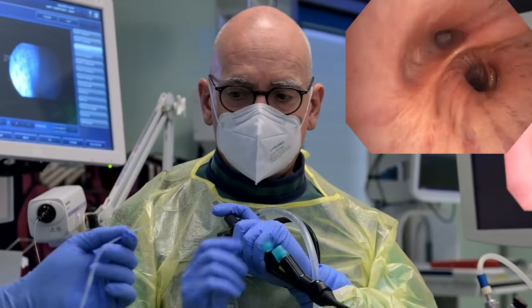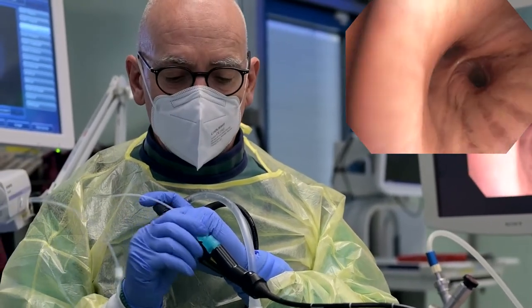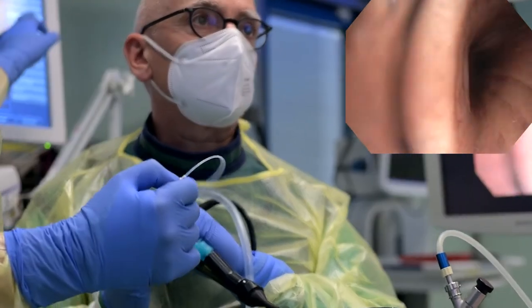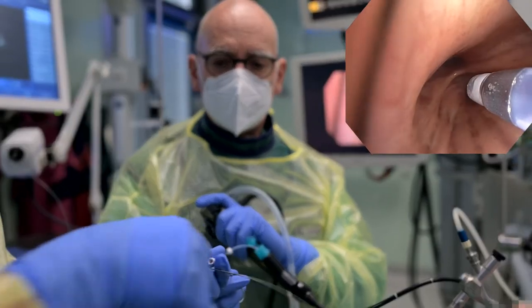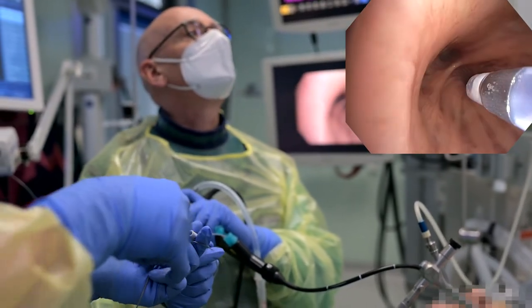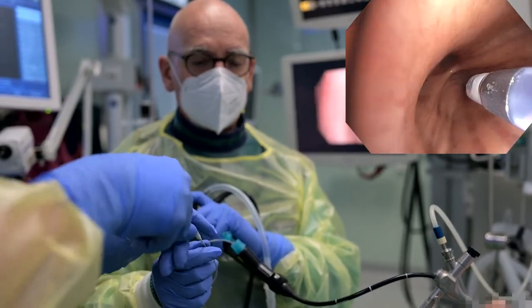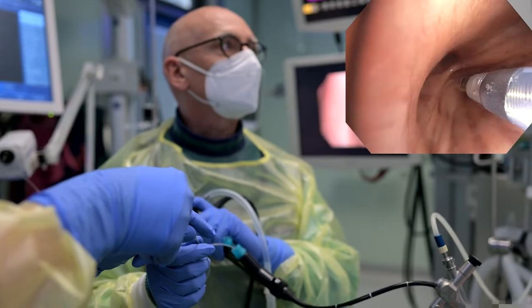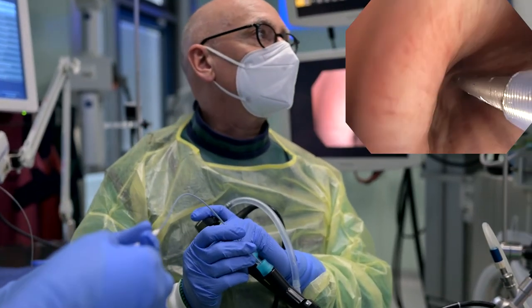For nodule localization, the guide sheath is inserted through the working channel and advanced to the region where the nodule is located. The radiopaque ring around the tip helps to visualize the distal end on a fluoroscopy image. Then the radial E-BUS probe is inserted into the guide sheath. Following sonographic confirmation of placement of the radial E-BUS probe in the lesion, a fluoroscopy image serves to illustrate this position in relation to the distal end of the guide sheath, as marked by the radiopaque ring.